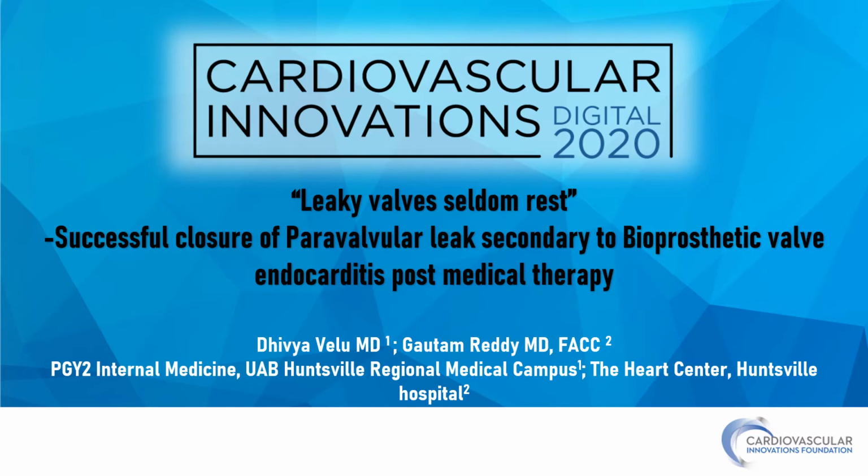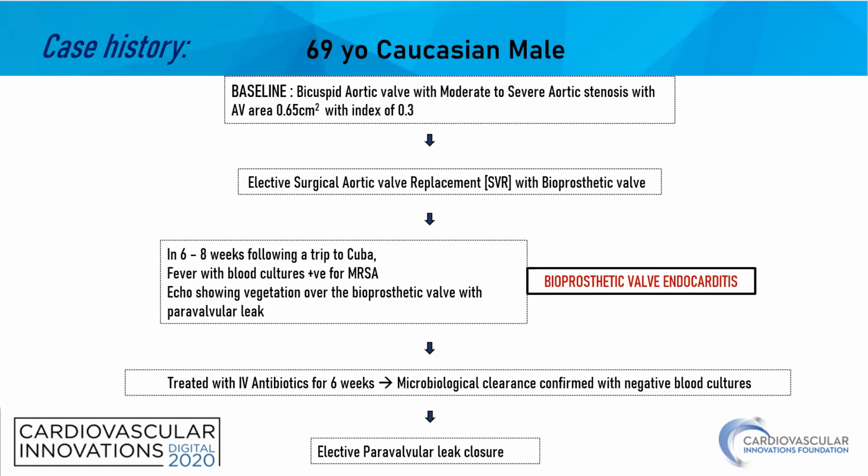I'm going to discuss with you a case on successful closure of paravalvular leak secondary to bioprosthetic valve endocarditis post-medical therapy. Let's start with the case presentation.